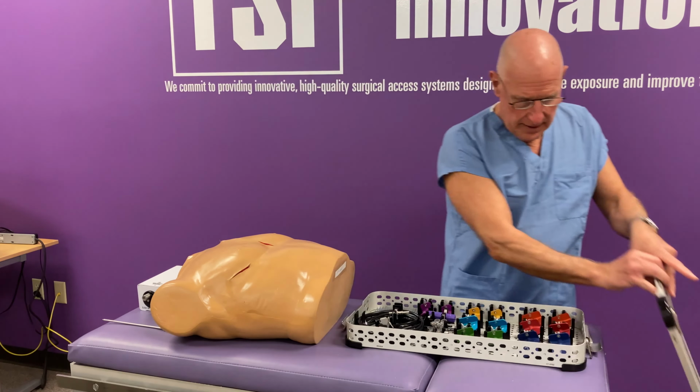Go ahead and use these hinges to conform it to the patient, and then we'll spread it open to the desired opening width. At this point, we're going to take this, the reusable light cable, and we're going to put it into the light channels.